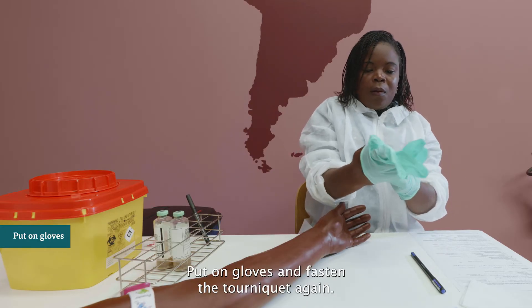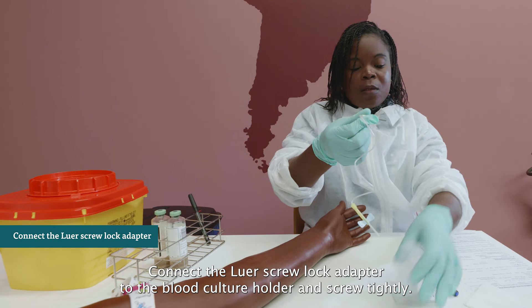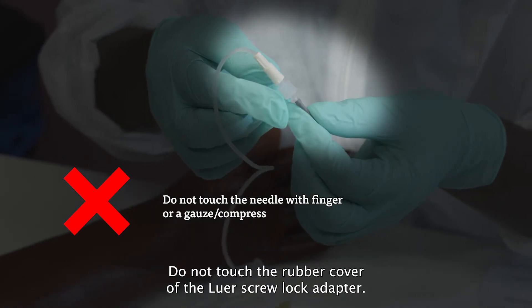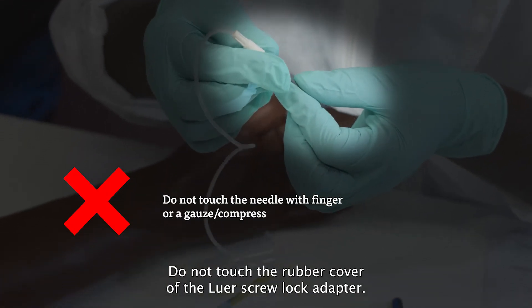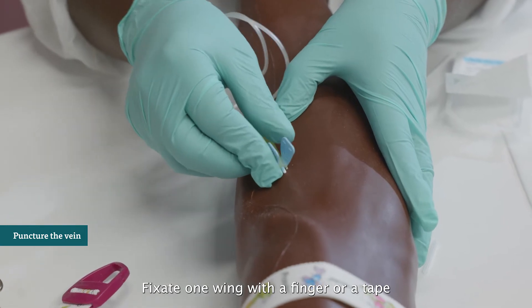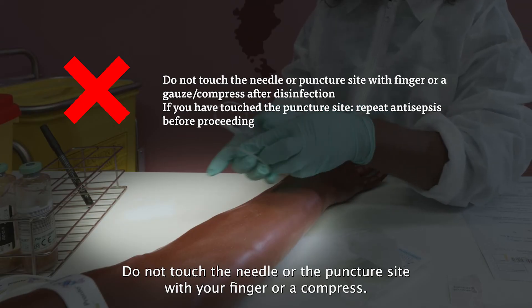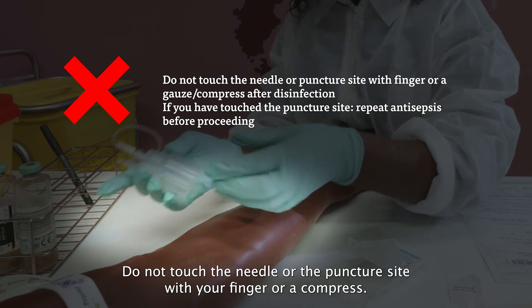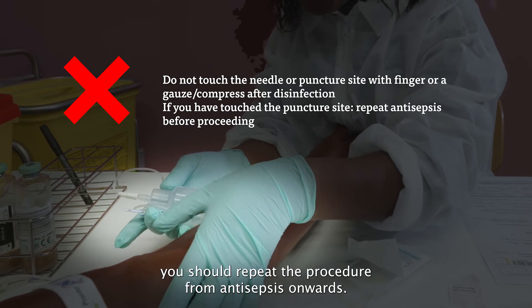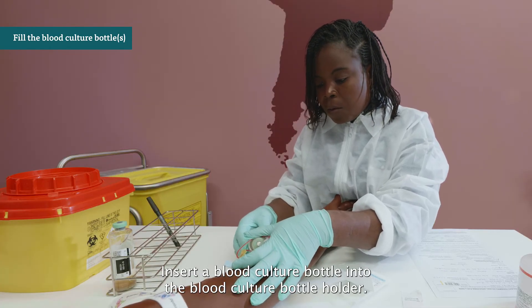Put on gloves and fasten the tourniquet again. Unwrap a butterfly needle from its package and connect the luer screw lock adapter to the blood culture holder, screwing tightly. Do not touch the rubber cover of the luer screw lock adapter. Puncture the vein with the butterfly needle and fixate one wing with a finger or tape to secure the needle during blood sampling. Do not touch the needle or the puncture site. If you have touched the puncture site, repeat the procedure from antisepsis onwards.